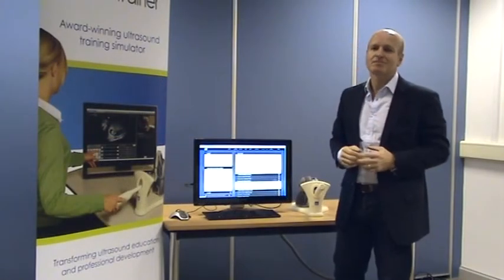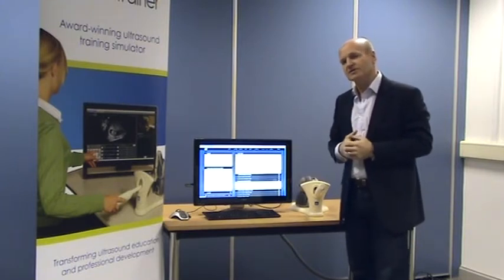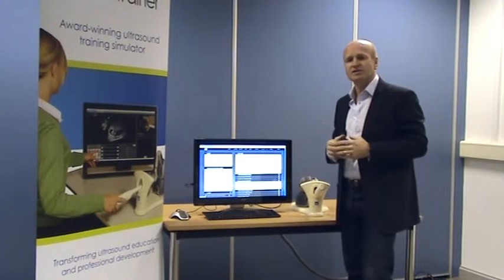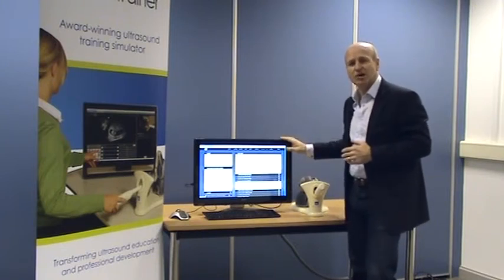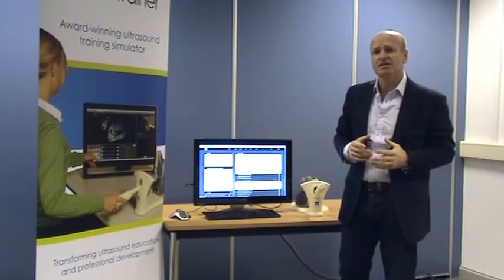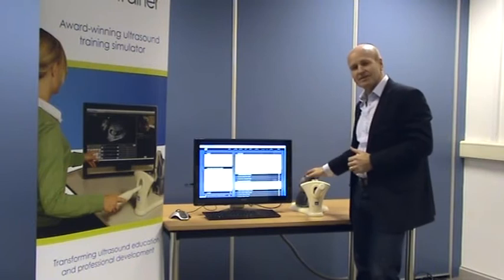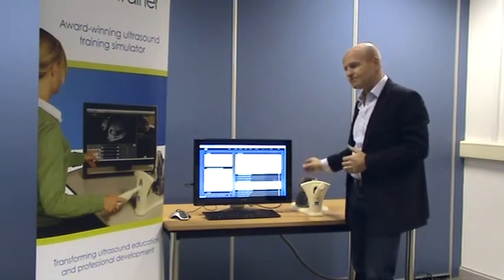8 years in the making, with input from some of the world's leading ultrasound experts. Scantrainer is a 24/7 virtual reality-based ultrasound training simulator that enables any level of practitioner to learn the key ultrasound scanning skills for examining the female pelvis.